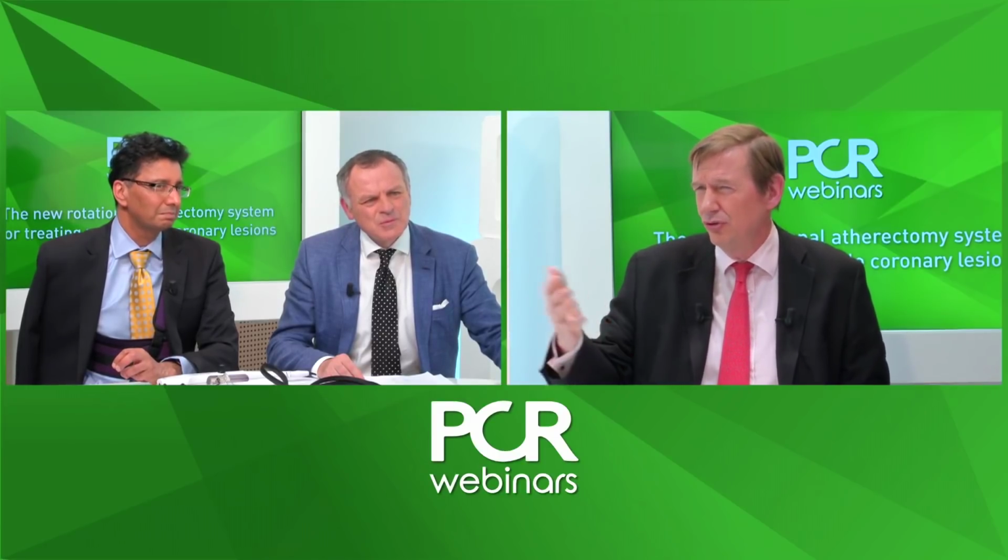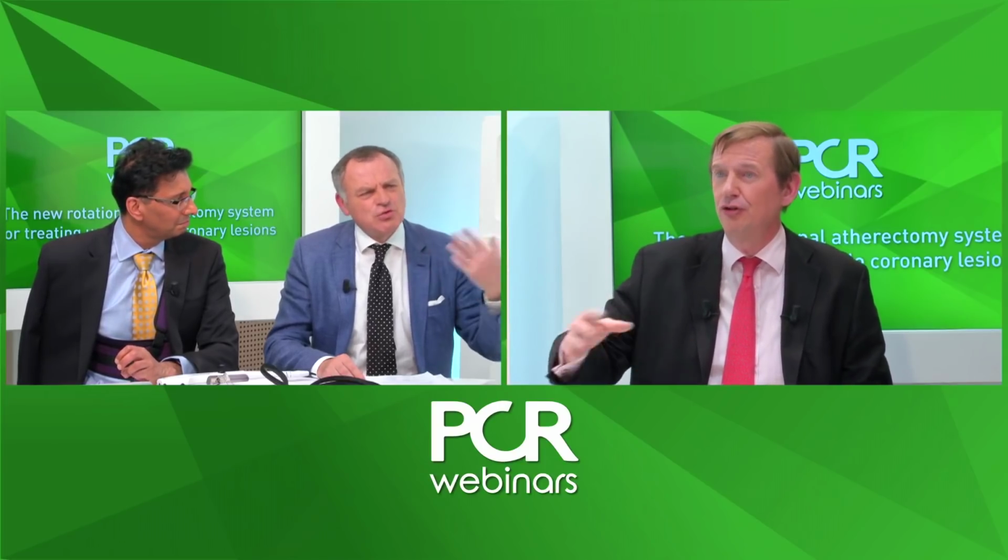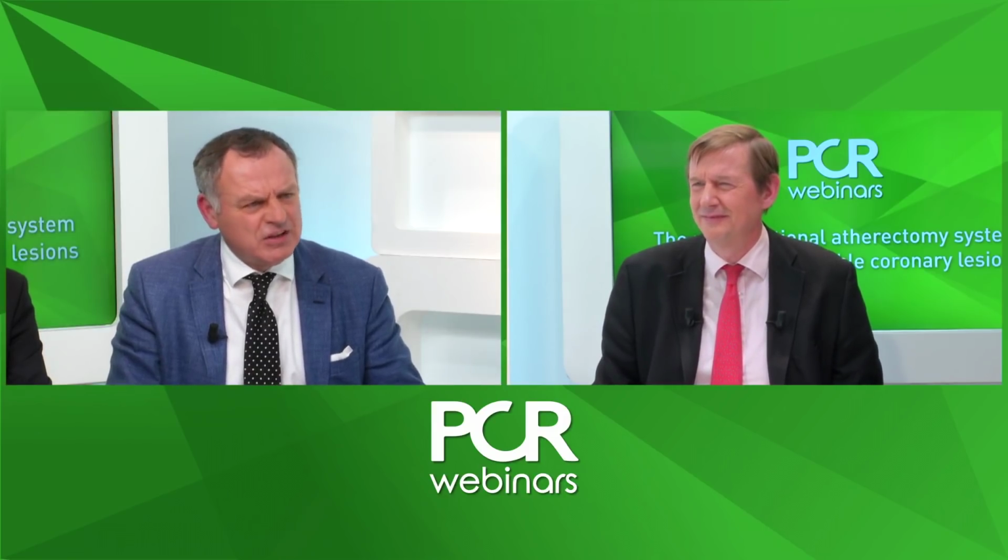Let's imagine you are doing it and your technician says, oh, your revs are coming down 20,000 RPM. Does that worry you? Do you change anything? You mean if deceleration is too great? That means that you have a bad technique. Normally, deceleration appears when you are too long inside the lesion, and it's something that you should absolutely avoid. You should never stop inside the lesion. You should always advance and retract the burr when you are rotating the burr.